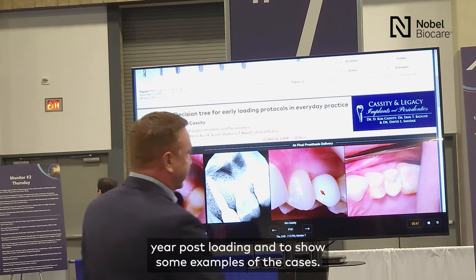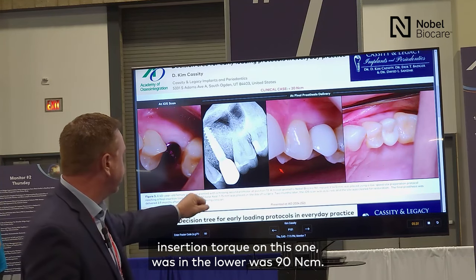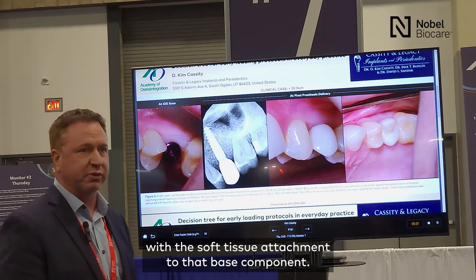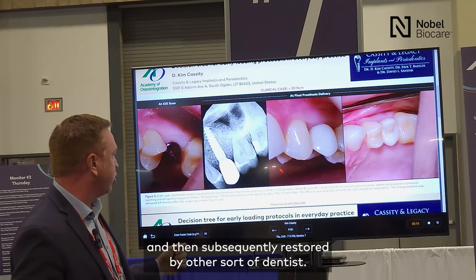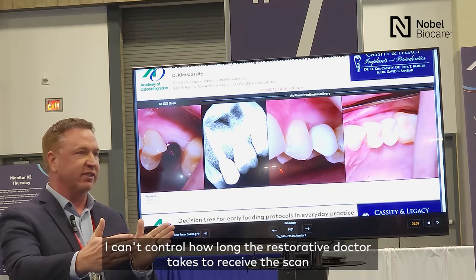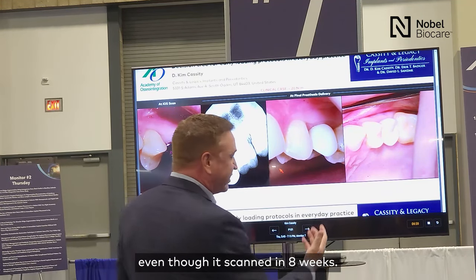Here's a case where implants were placed with an insertion torque of 19 newton centimeters. With this protocol, we were placing the N1 base with all of our implants to get the added biological benefits. The N1 base provides soft tissue attachment to that base component. It was subsequently scanned at eight weeks and then restored by the restorative dentist. This was a private practice study, so the restoration was delivered at approximately 3.9 months, even though it was scanned at eight weeks.